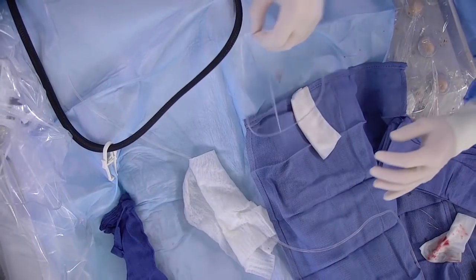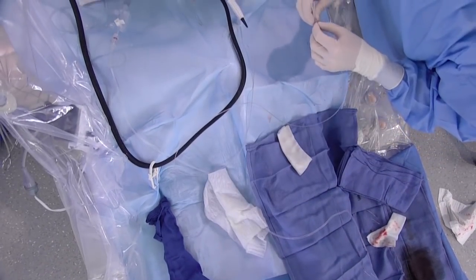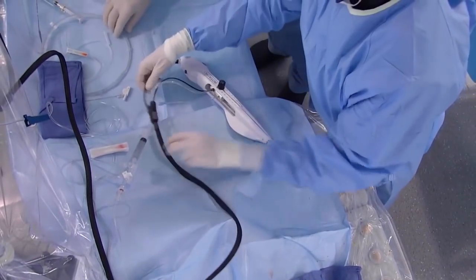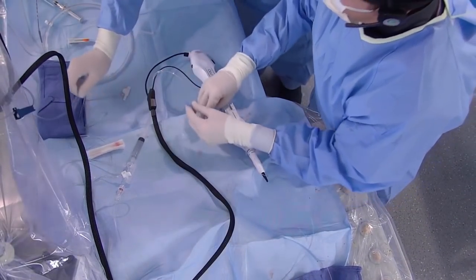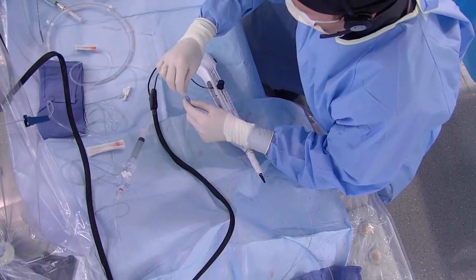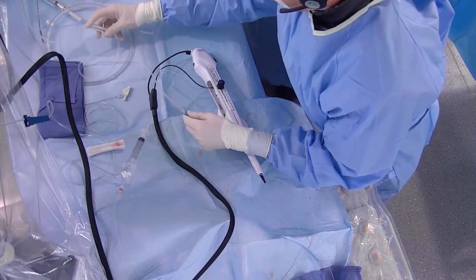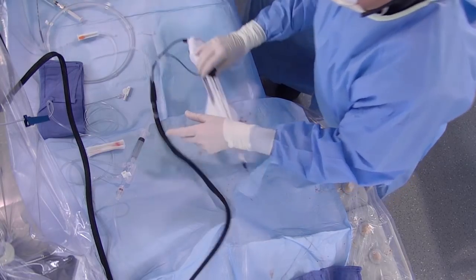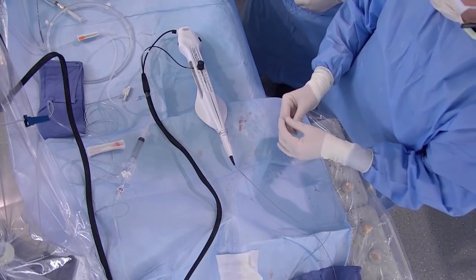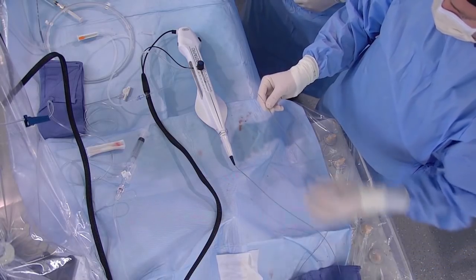So the new cable is quite bulky, and you just need to make sure it's well out of the way and doesn't get involved in the mechanism. Then there is no pedal, so I start to place the flush. I open it. Can I ask you, what do you put in the flush, Nicolas? So there is saline, nitro, and heparin.